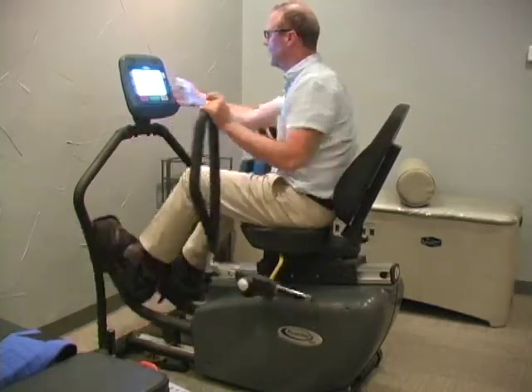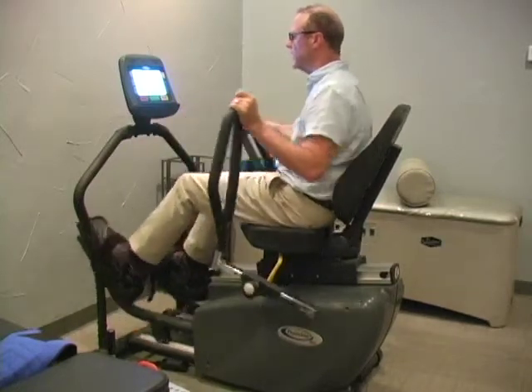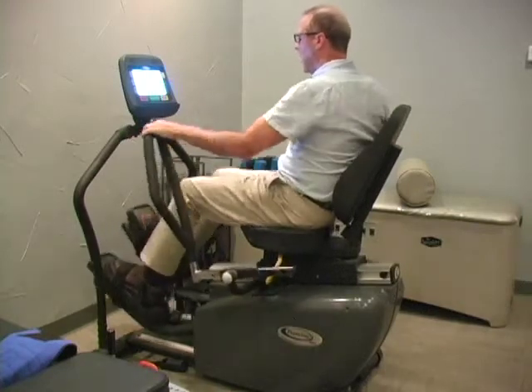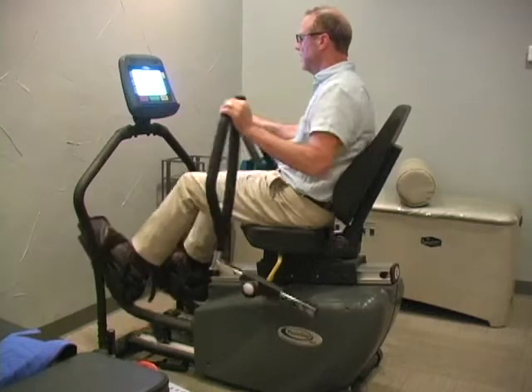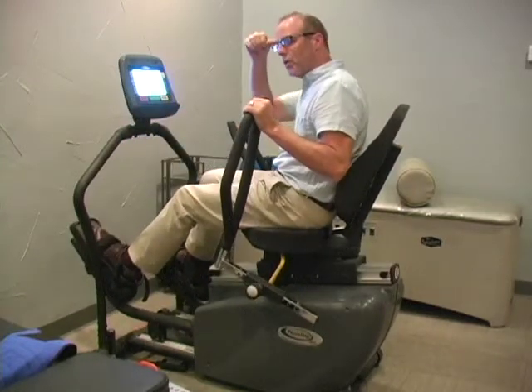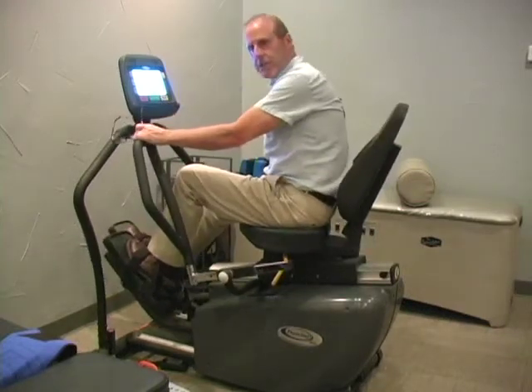The average person with minimal strength can handle at least a level four at first. Applying resistance, we want to do this at least eight minutes. Level four is the minimum.